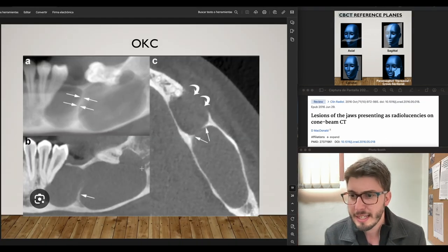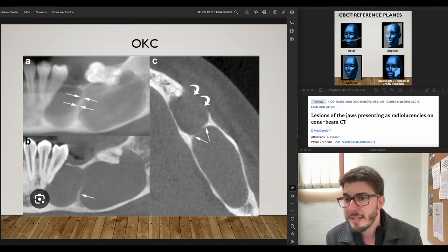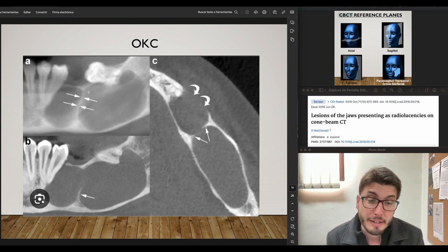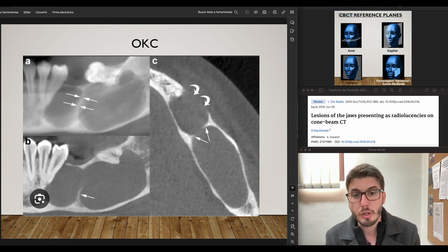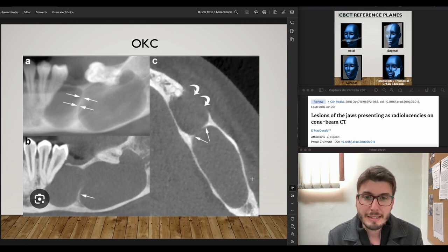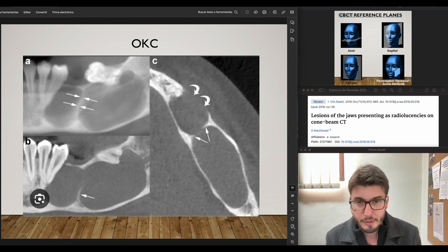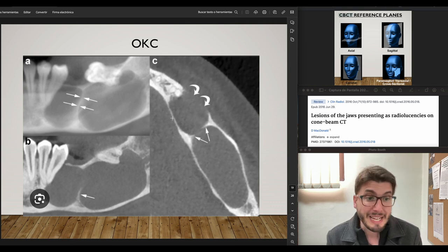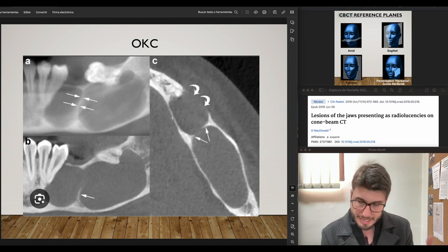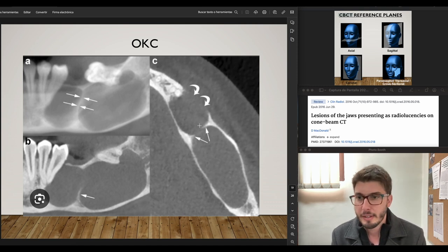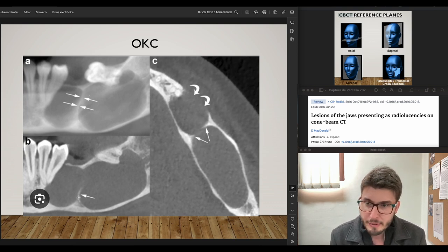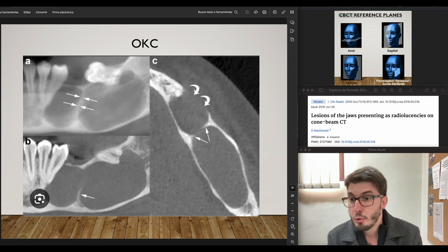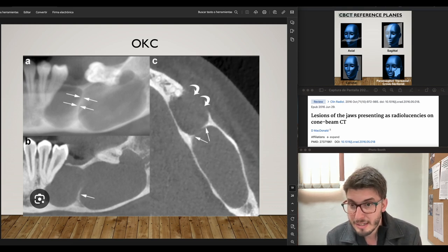Now an OKC case. A very common characteristic of OKCs visible in CBCT is that they are long lesions mesio-distally, with less buccal-lingual plate expansion as compared with an ameloblastoma. They can also be multilocular, though usually they are unilocular. There is always the risk of recurrence, and we see root displacement here — all the aggressiveness of the lesion.